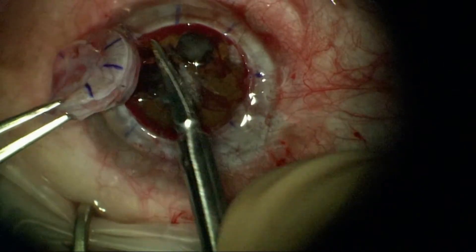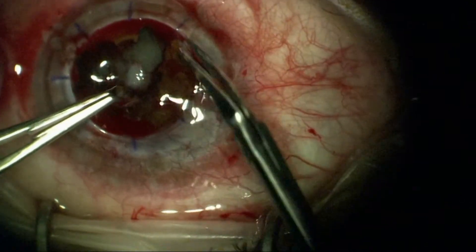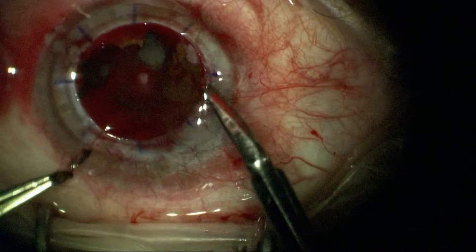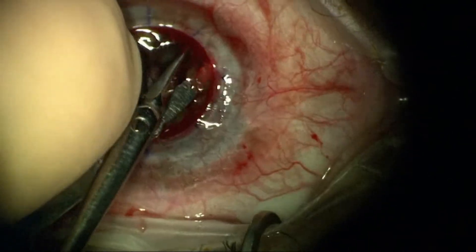I'll remove any non-viable tissue that is causing a problem and is not salvageable. There is a lot of vascularity here due to the previous inflammation and infection, and you can also see that there's a fairly dense cataract.